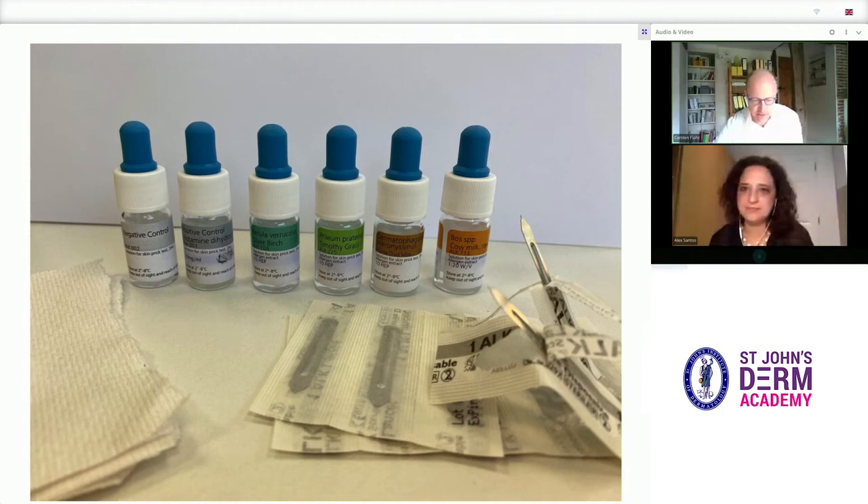Here you see the equipment that we use: allergen extract solutions alongside positive and negative control solutions, strips of paper towel, and lancets as well.